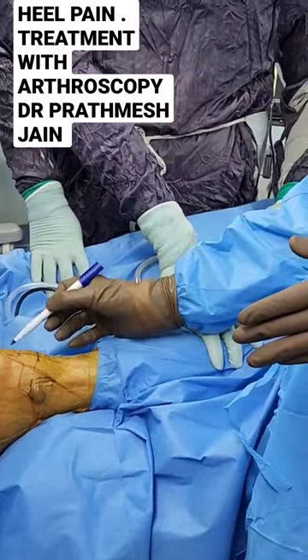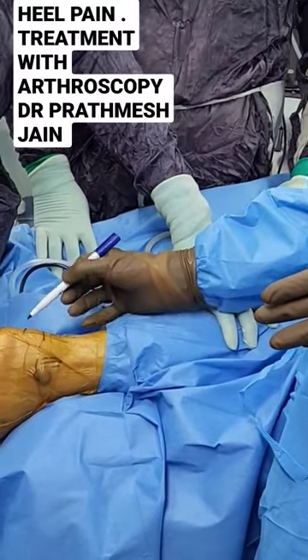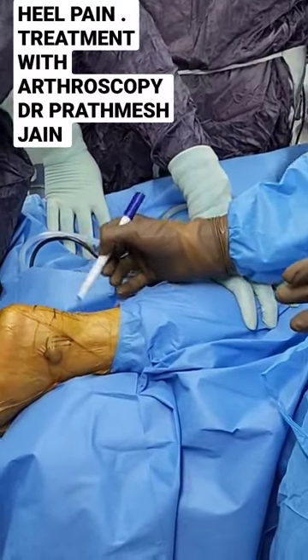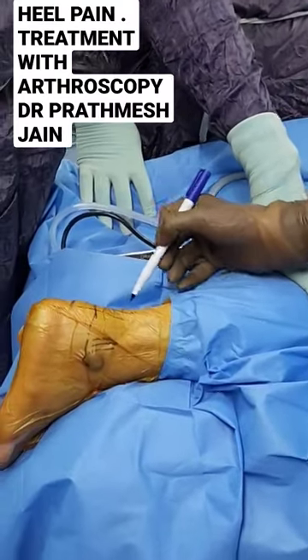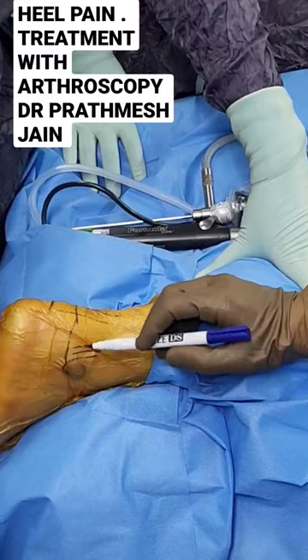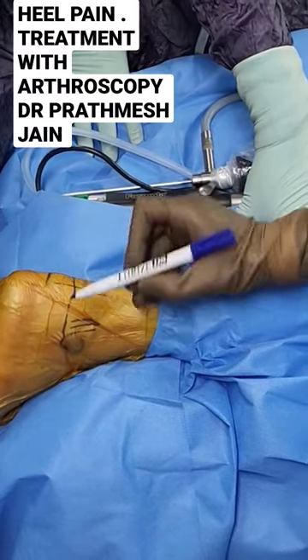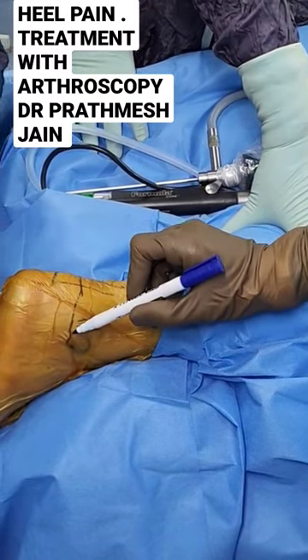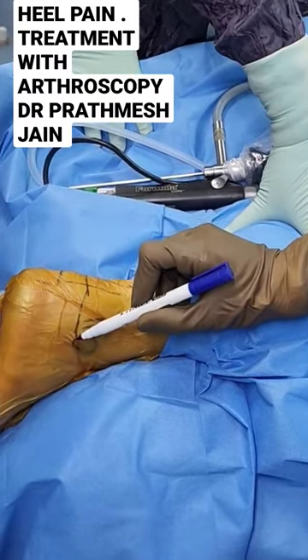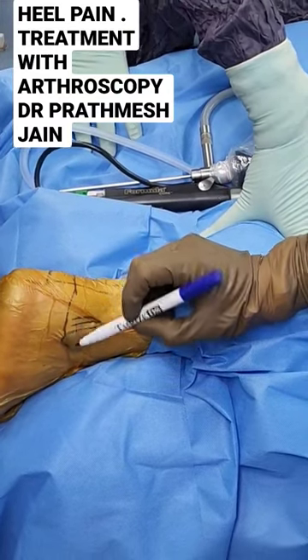Here we can see the Haglund deformity, which we have marked. This is the position of the Achilles tendon, this is the lateral malleolus, these are the peroneal tendons, and we draw a line which connects the two malleoli.